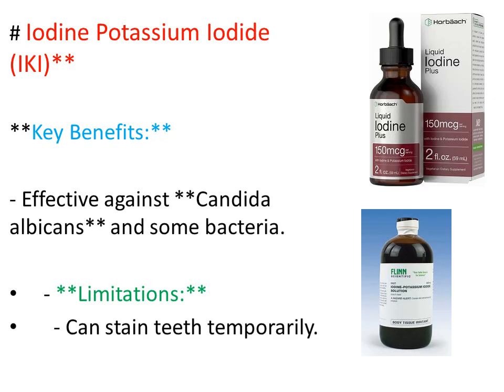Then we have iodine potassium iodide, IKI, which is very effective against fungi, Candida albicans, as well as some bacteria. So it helps prevent secondary infections in the canal, but it has a limitation: it can stain teeth temporarily because iodine is a colored product.